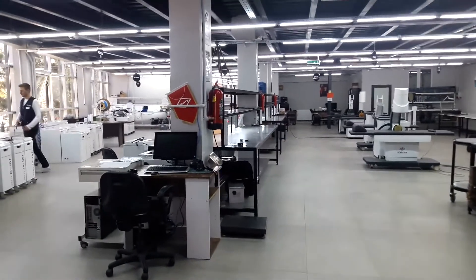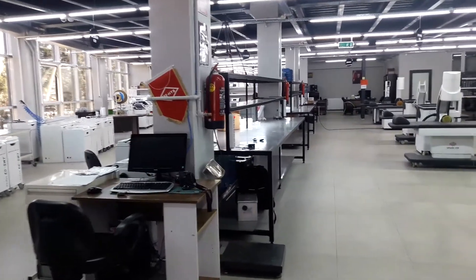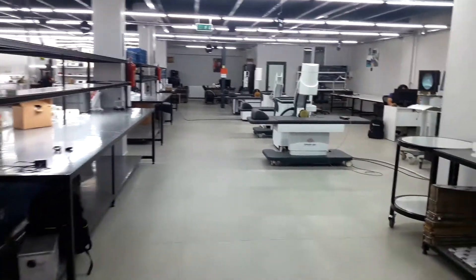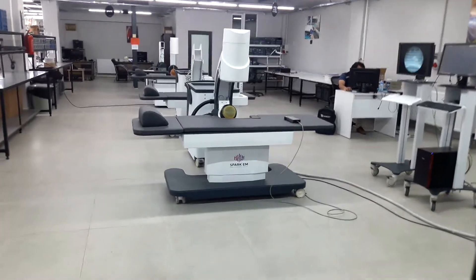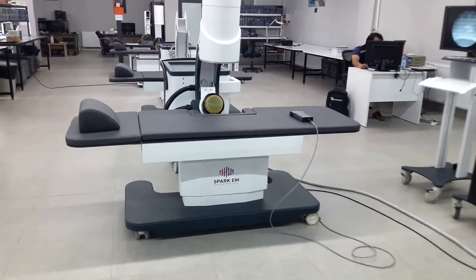I'm going to show you our ESWL lithotripsy systems. We have two different models: electromagnetic and electro-hydraulic.